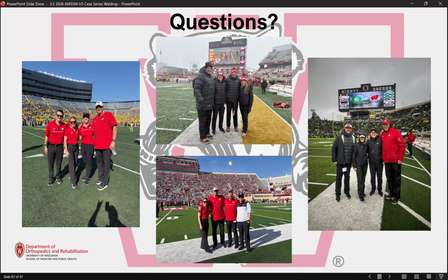One thing I was going to add for the protocol in this area, that sometimes I'll do depending on the patient presentation, is going to be the pre-patellar bursa. I've just been surprised, obviously sometimes with trauma in that area, that those can become very large and distended, and especially where they're occurring as well.